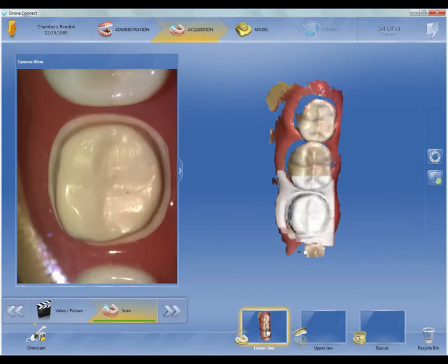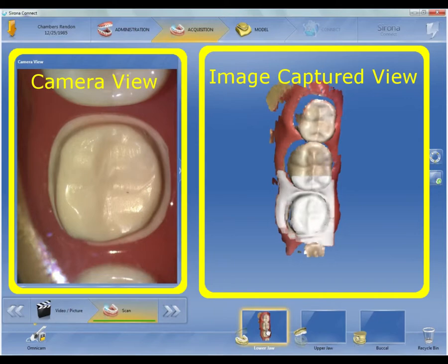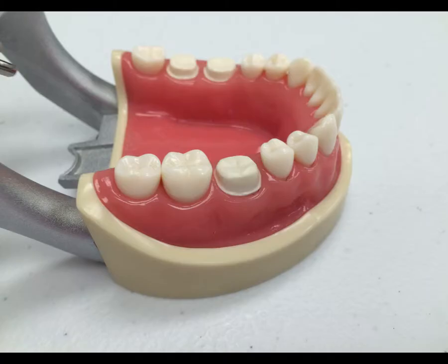Here we have our acquisition phase. This is where we'll have our different views that we'll be seeing. We'll use our camera view, which shows us inside the patient's mouth what we're actually acquiring. Here we have the image capture view, which shows us the models being created from those images we're scanning. Below that we have the areas to be captured: our lower jaw, upper jaw, and our buccal bite catalogs. These are where we'll store the images.